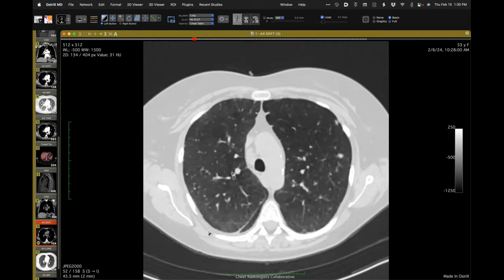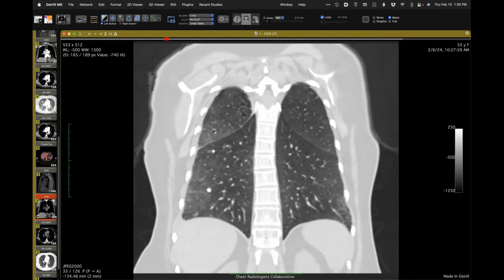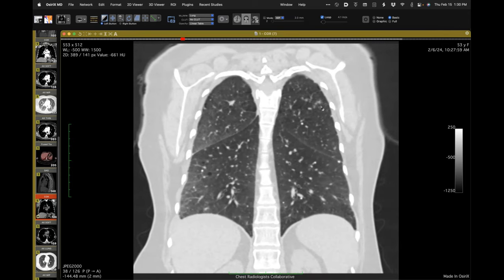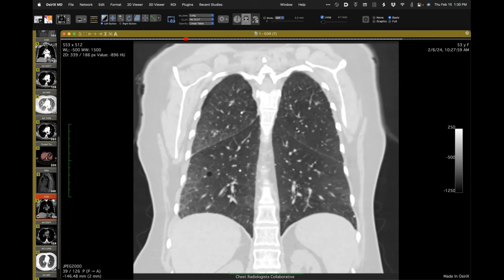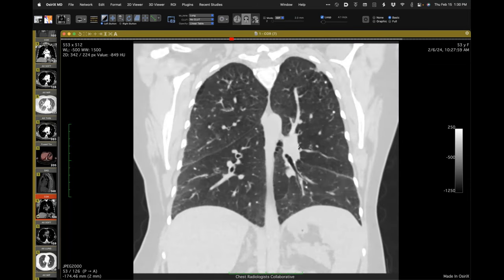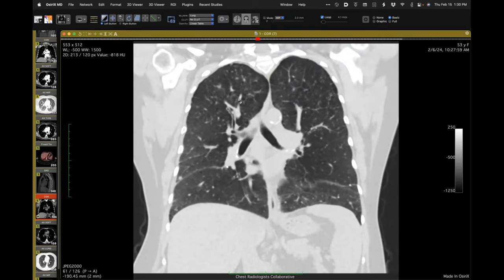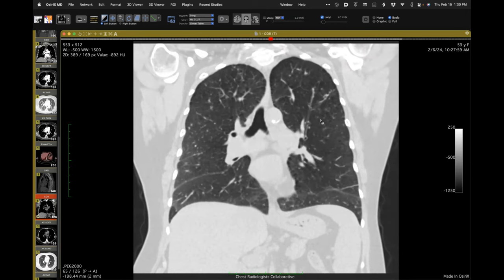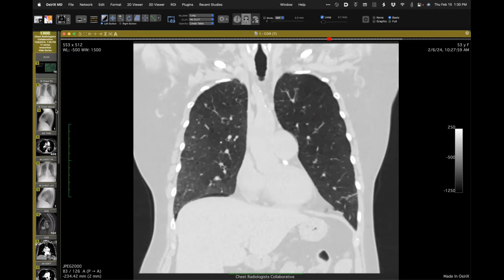Looking at the coronal, it really nicely shows the morphology of the non-calcified nodules up here. I'll pause momentarily at some that are stellate-shaped — up here and here — irregularly shaped nodules, kind of stellate. I said, this is supertypical for PLCH.